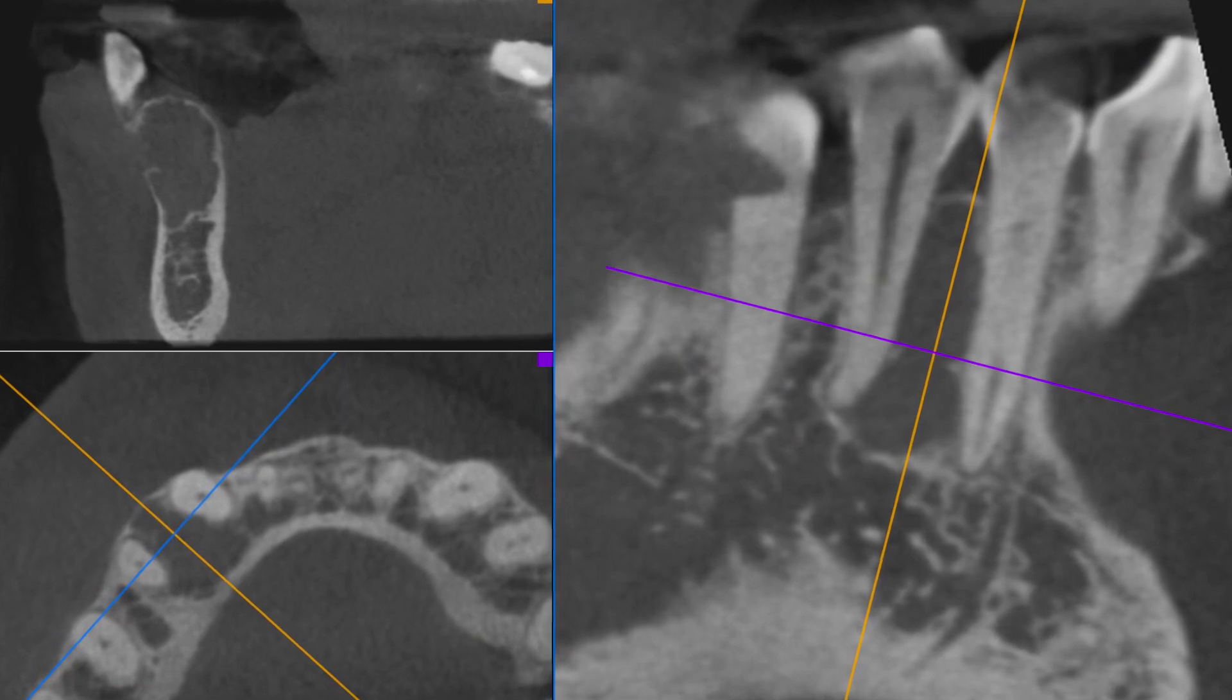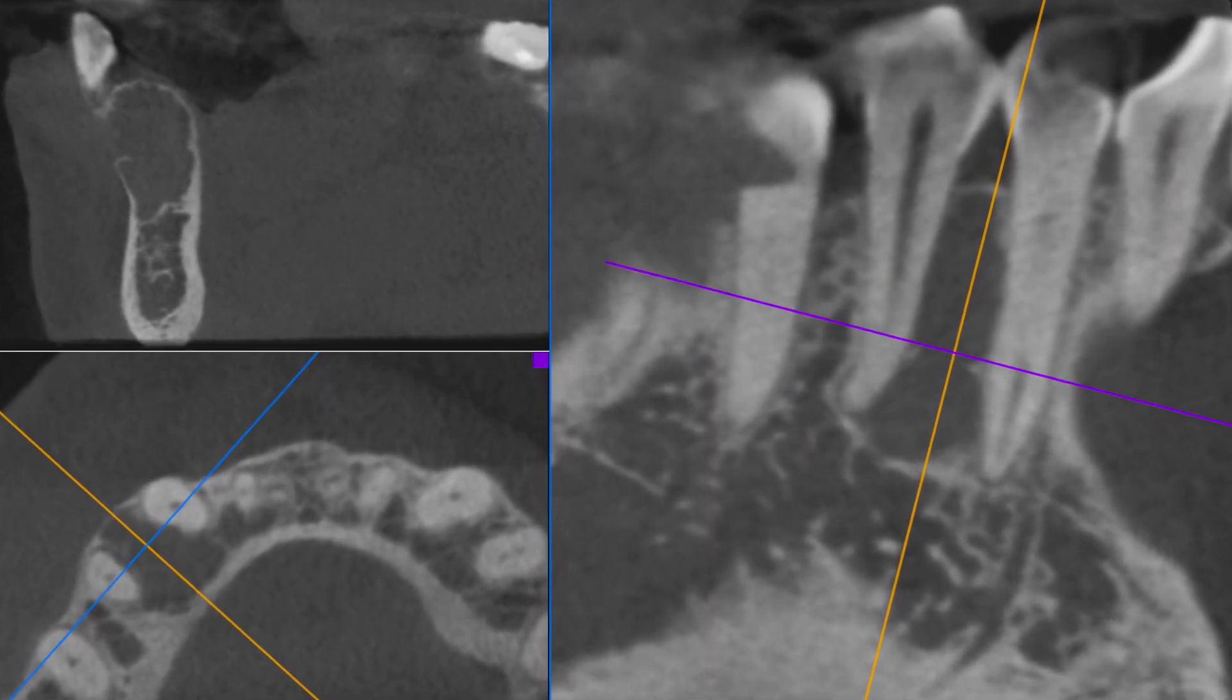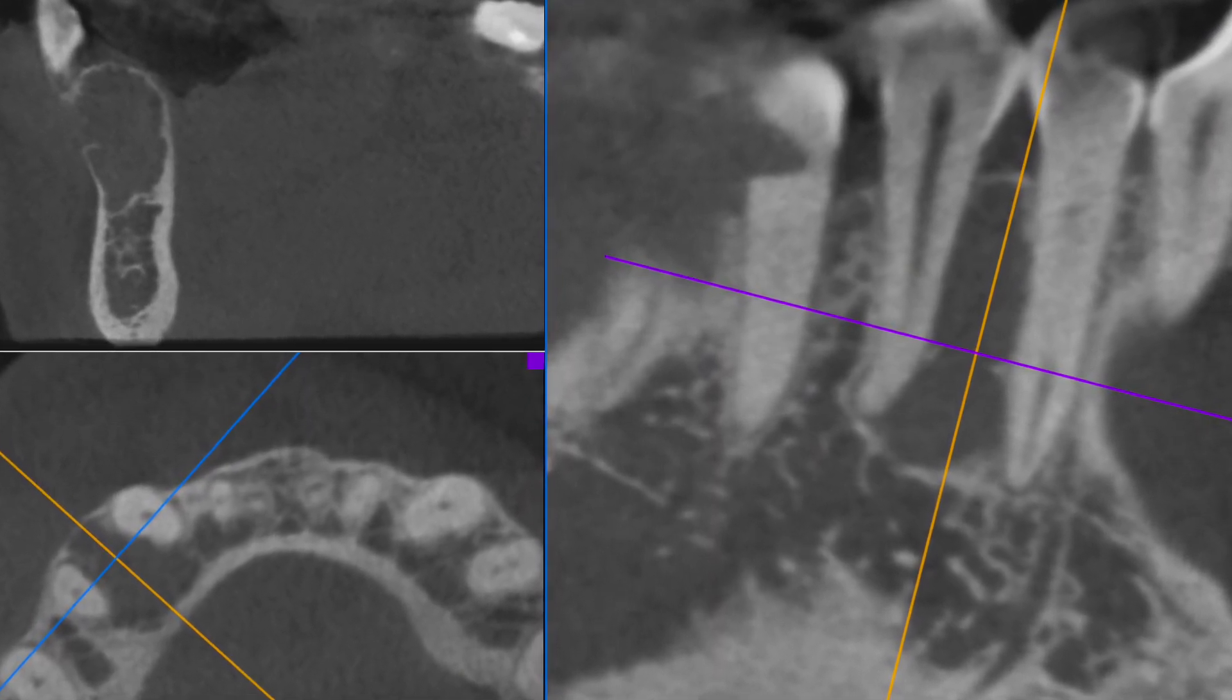Usually with no buccal and lingual expansion and of course very well limited. Of course this lesion can lead to root displacement and even buccal plate expansion and resorption like this case here when the lesion has been developing for a long time.